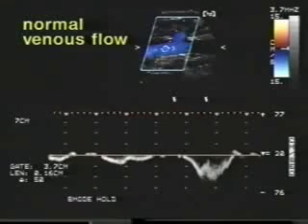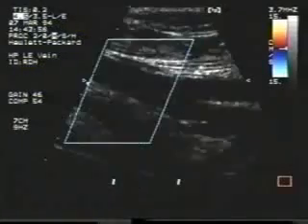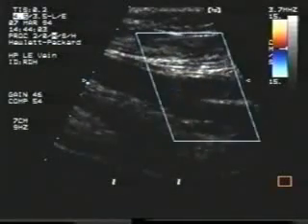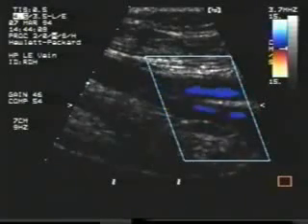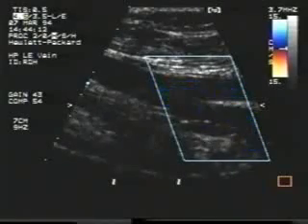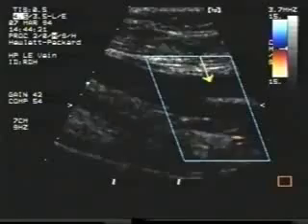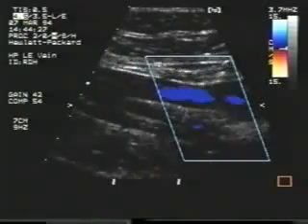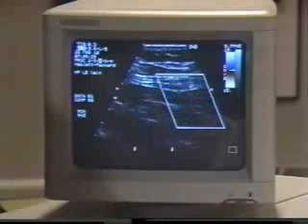If the Doppler flow is not spontaneous, phasic, and augmentable, you need to investigate further. Now move to the junction of the femoral and the profunda femoris veins. Here you will need to adjust steering because the vessel takes a slight change in direction. Also invert the map to keep the color display blue for the vein. This bifurcation is a common site of thrombus collection. Follow the femoral vein along the thigh — color flow is a useful tool to evaluate a partially occlusive thrombus. If you see color, you know that blood is getting through, but be careful not to have the color gain set so high that it obscures any thrombus.